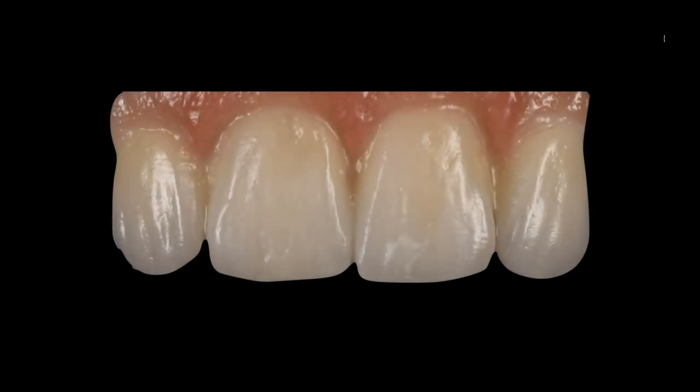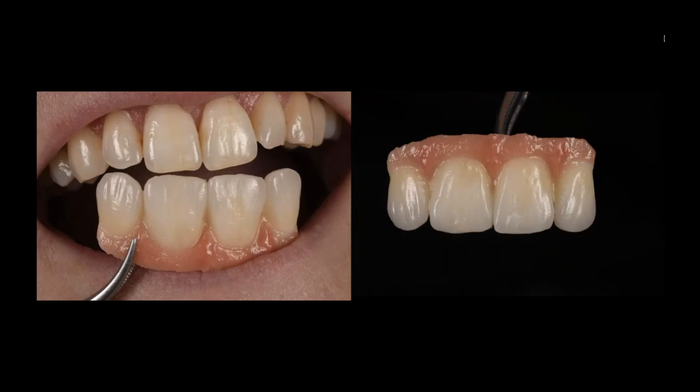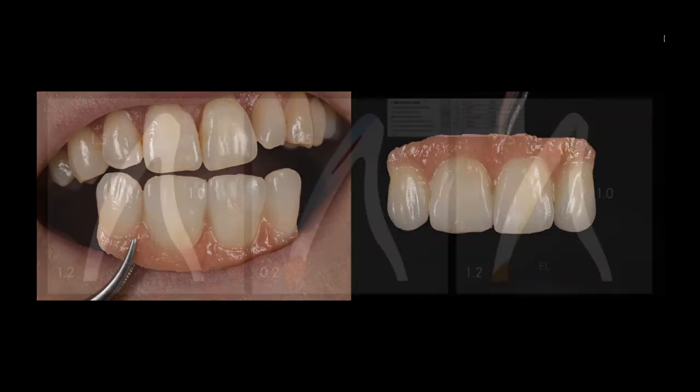And again, these are minimal buildups. These are very small amount of powder buildups, especially on the two laterals, which again, were almost micro-layered. I probably only used about three powders on them. So they become very simple. And I think for a live course, you can see we were fairly close. I wouldn't say it's perfect, but we were fairly close to what we were building up in someone else's kitchen.